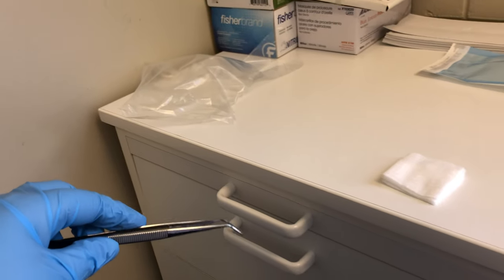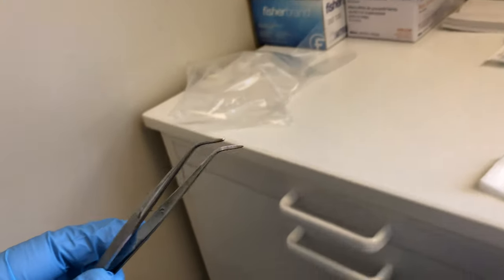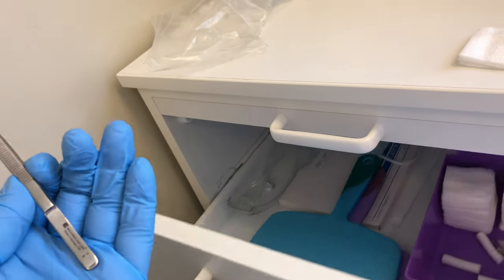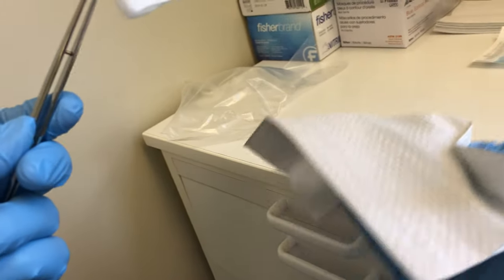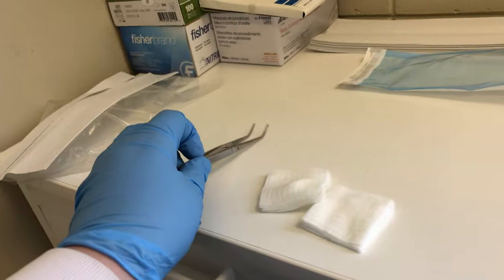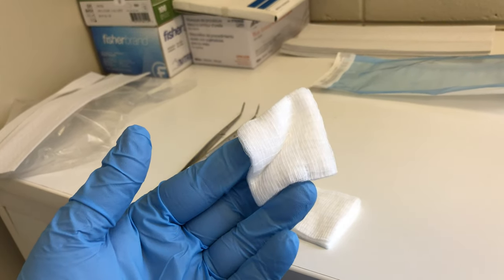To get into the drawer without overgloves, the best way to open it is with a piece of gauze or a paper towel. Use that barrier to open the drawer so you don't touch the handle with your dirty gloves. Use the cotton pliers to pick up what you need, then close the drawer with the gauze or paper towel. Set the barrier to the side for disposal after the procedure, and keep your cotton pliers on your side so it doesn't get confused with the doctor's. Now you're ready to return to the patient.